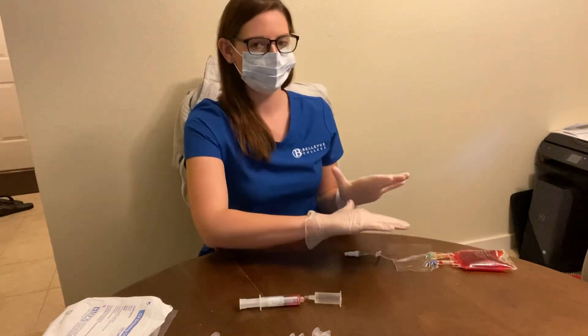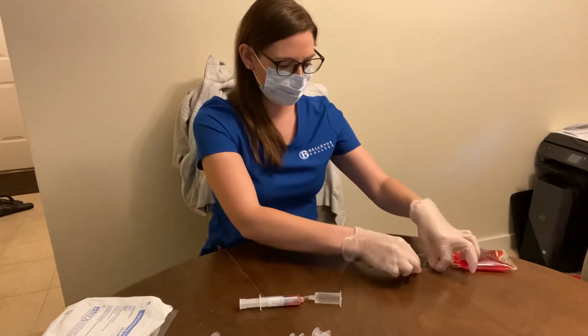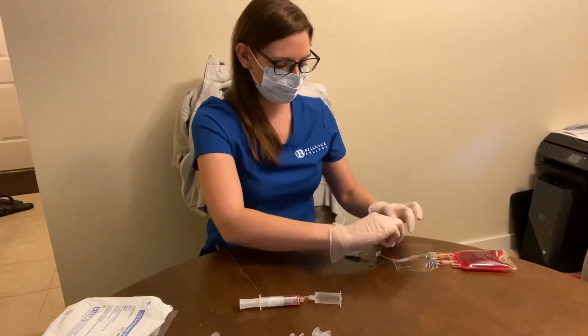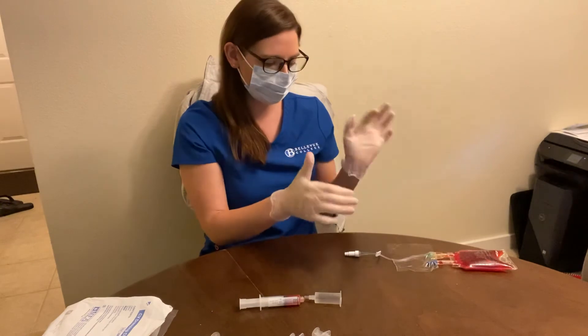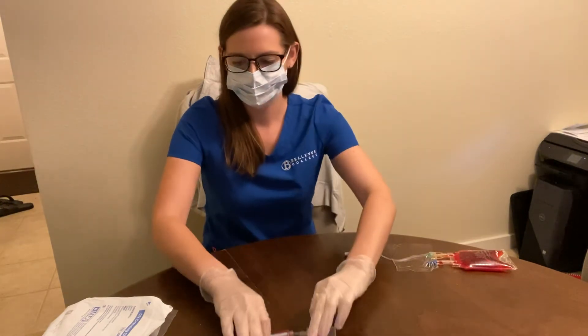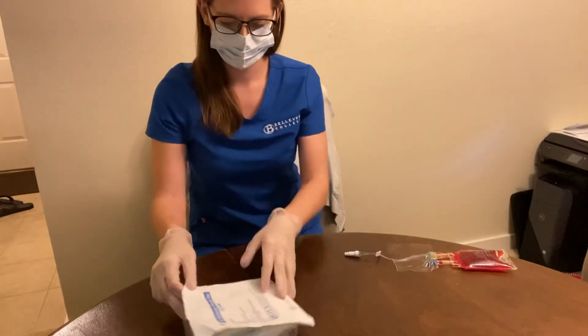I'm going to tell my patient to look away. Because we don't have any extra Tegaderm strips, I'll describe what I would do: I would be pulling up the sides of the Tegaderm strip while inspecting the site, then pulling it off, making sure there's no tenderness and no redness.